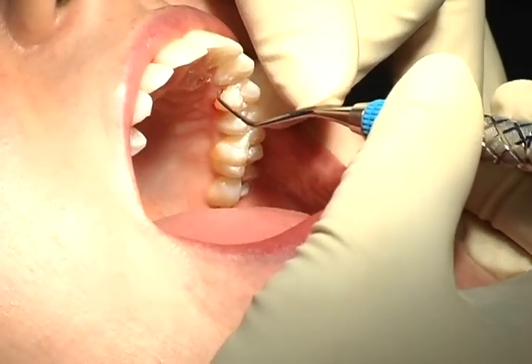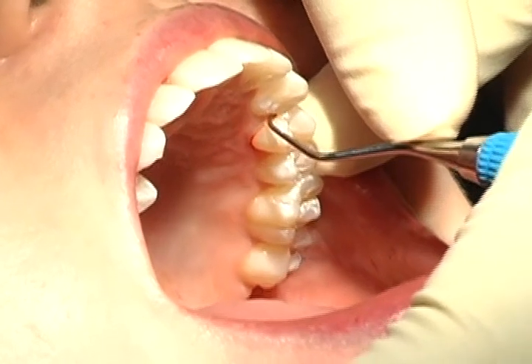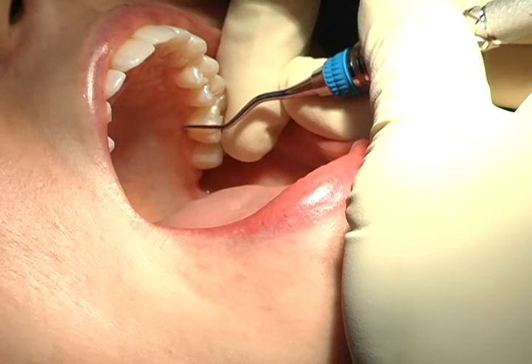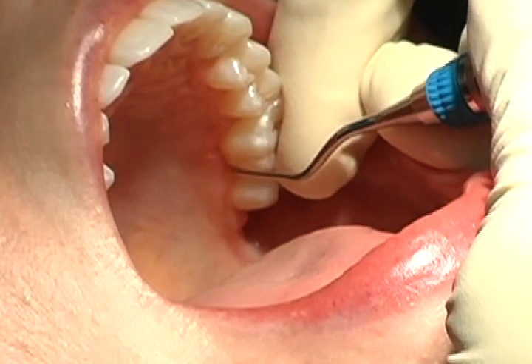The Micro Mini 7-8 is great for accessing the buccal and lingual aspects efficiently. The Micro Mini 5 11-12 and 13-14 are ideal for accessing molar anatomy with ease.